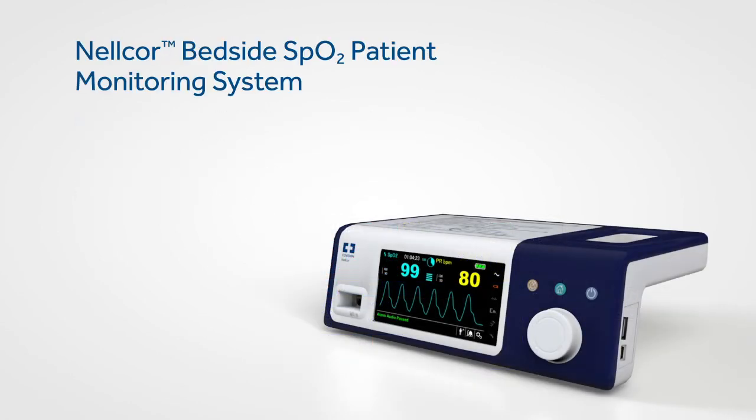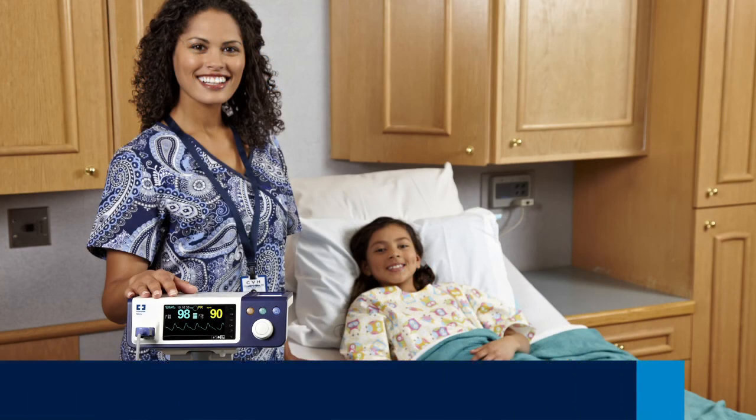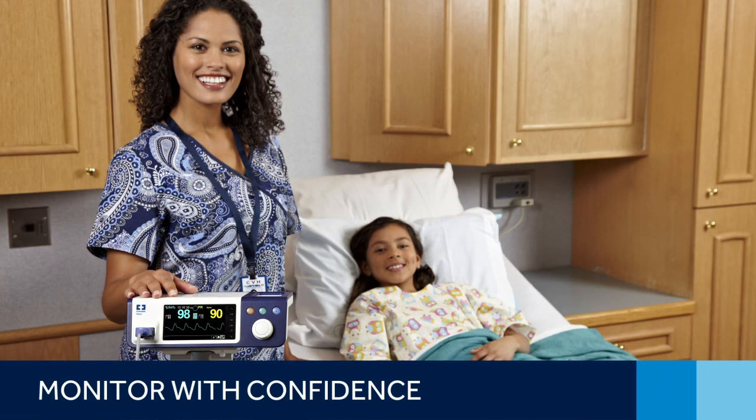With its easily accessible features and user-friendly interface, the Nelcore bedside SpO2 patient monitoring system makes it easy to access critical patient information. Clinicians can feel confident in the ability to detect respiratory complications earlier and intervene sooner. It all adds up to better patient care.